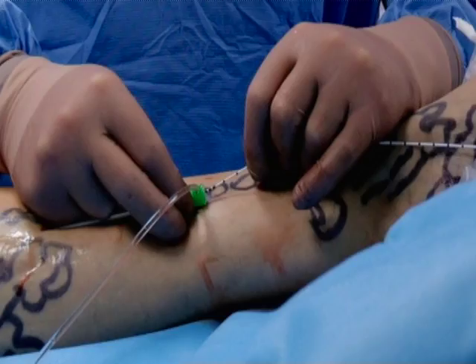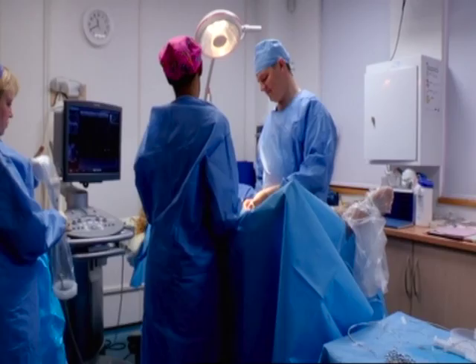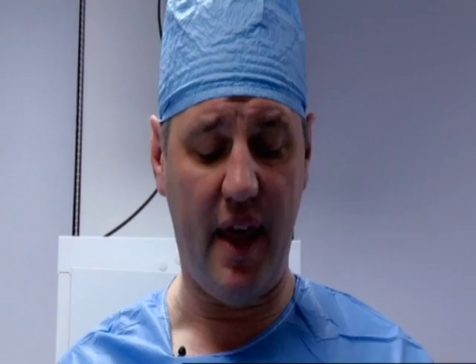For the next two and a half hours, the 1000 degree laser burns away each of the veins, but this doesn't solve the whole problem. If we don't remove the baggy veins on the surface, they will end up getting little clots in them called phlebitis, which will be very painful and will look awful.